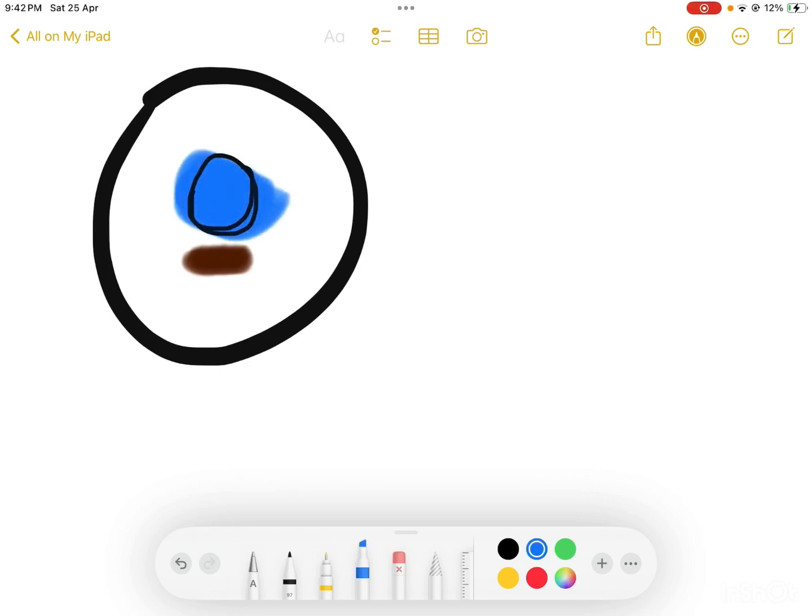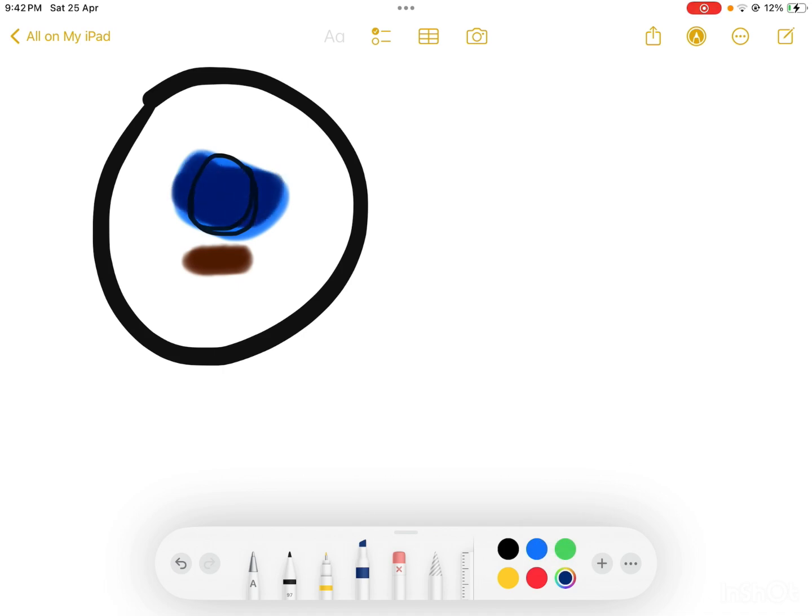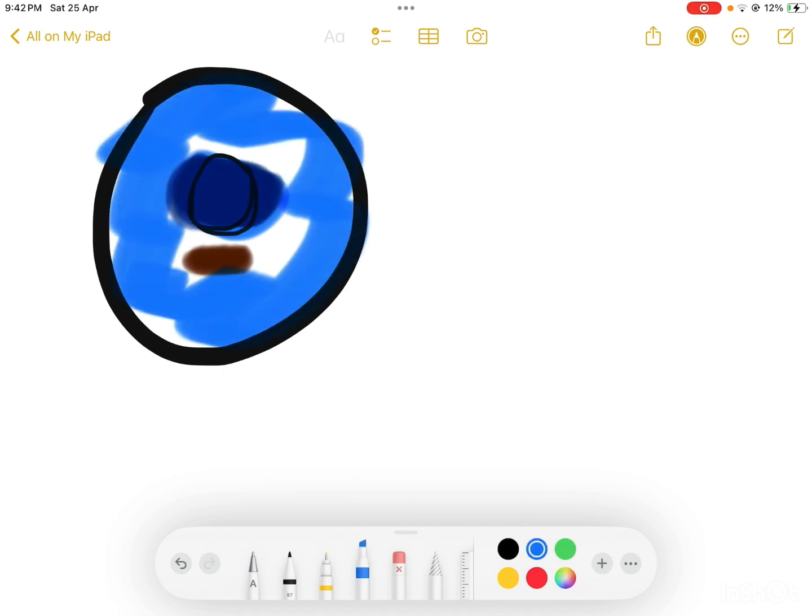So you will be seeing the nucleus which is very well highlighted. Suppose you are thinking this is dark blue, and then you will have this as light blue. You have to look in high power to understand there is dot like positivity.